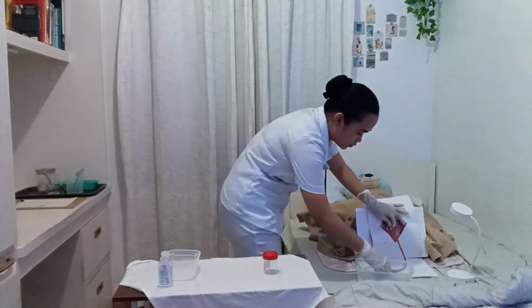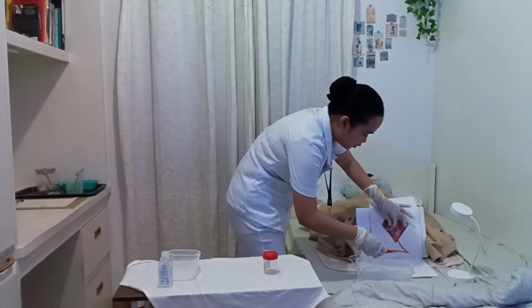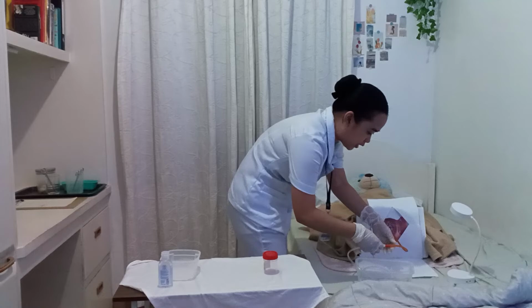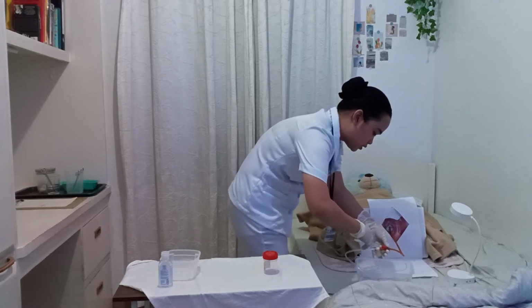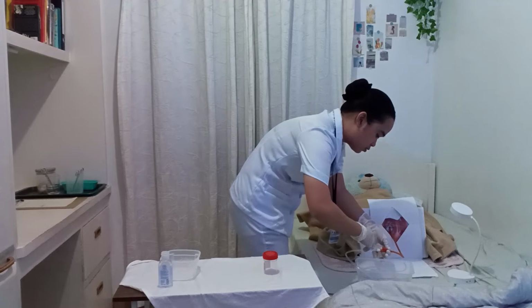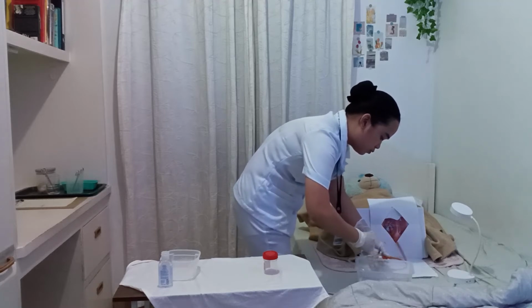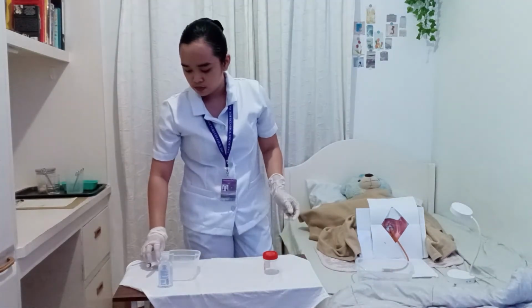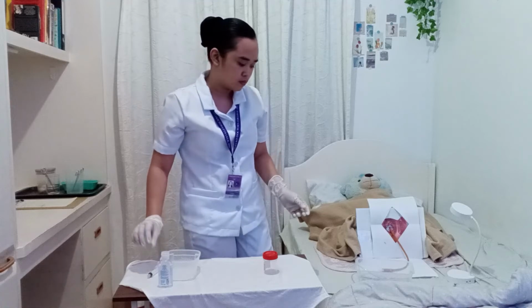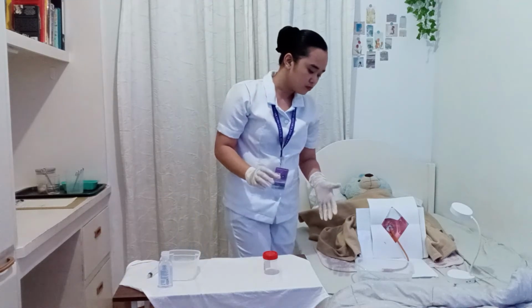Okay? So you already connected the syringe and the catheter a while ago. So we're going to administer the sterile water now. Then we're going to remove the syringe. Okay.